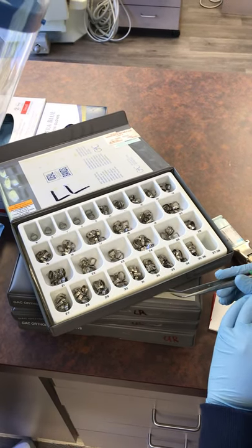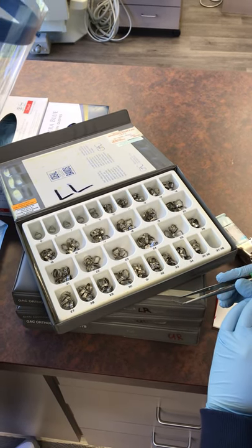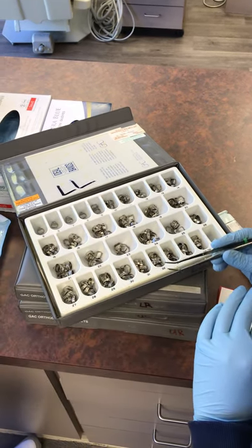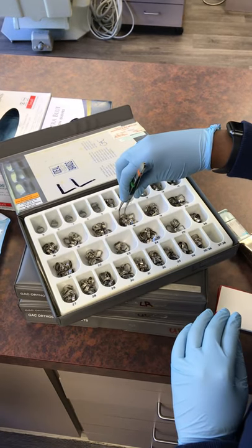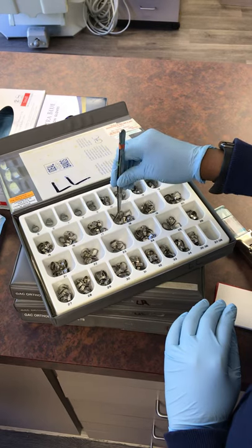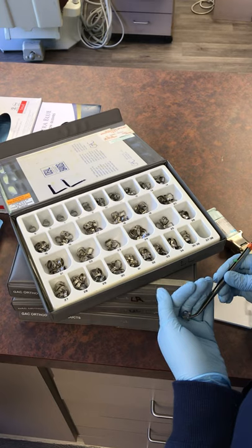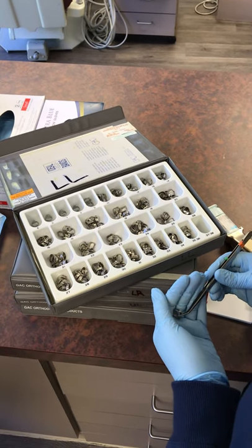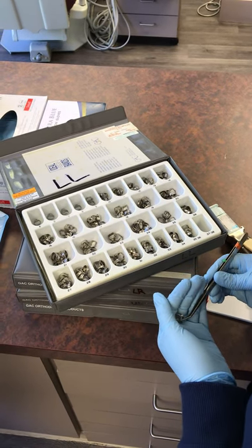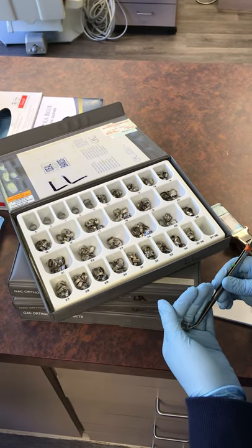I'm going to start with an 18. Now this is just a guess — I'm eyeballing it based on the size of the tooth I saw in the mouth, and looking at the bands and saying: is this too big? Is a 22 too big? Is a 15 too small? Somewhere in the middle is where we're going to start. It might be a little too small or a little too big — we're going to find out as we try it on.